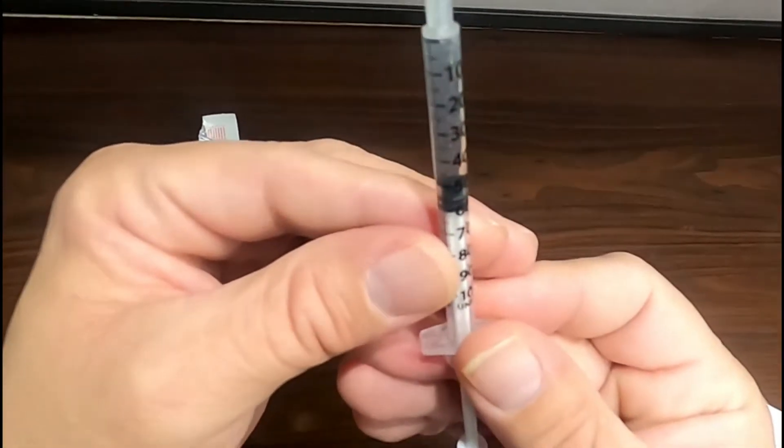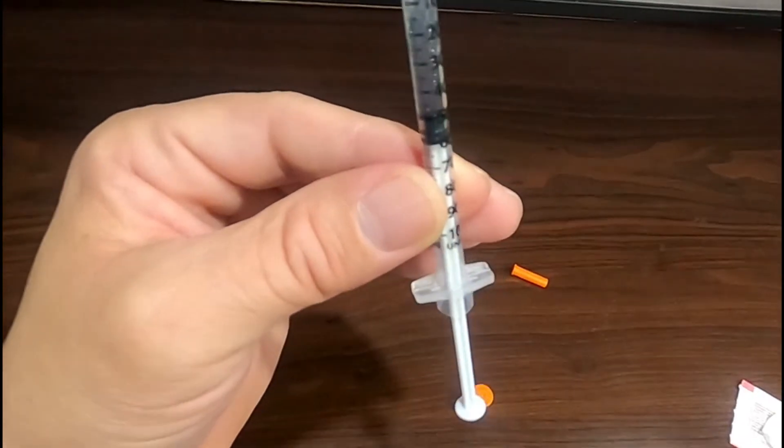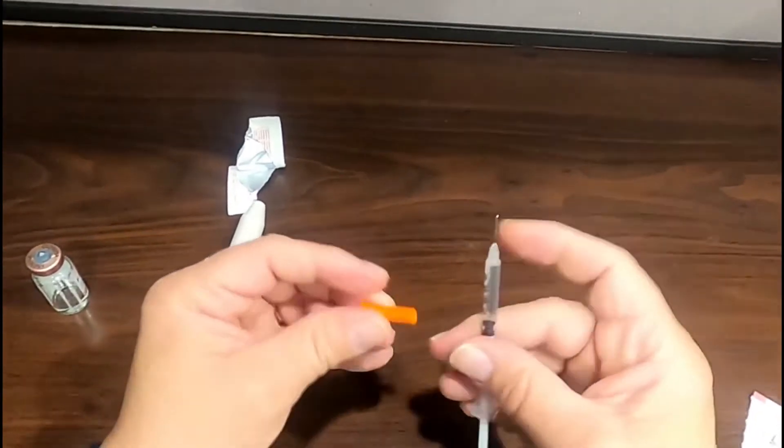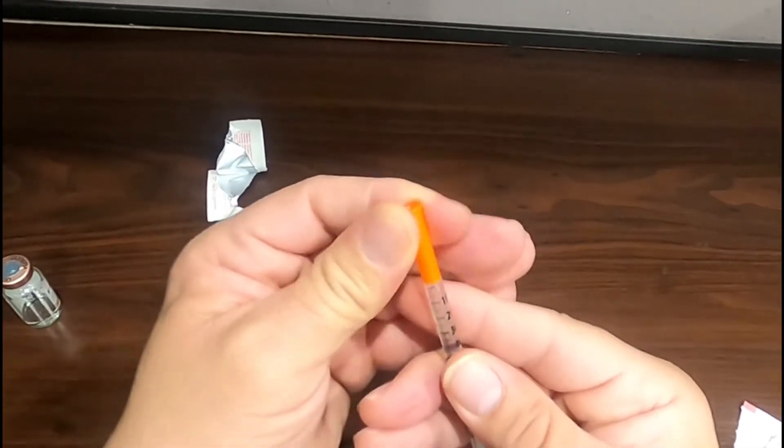This is a good time to double check the amount of medication in the syringe. Recap your needle with the orange cap just to make sure it doesn't get damaged.